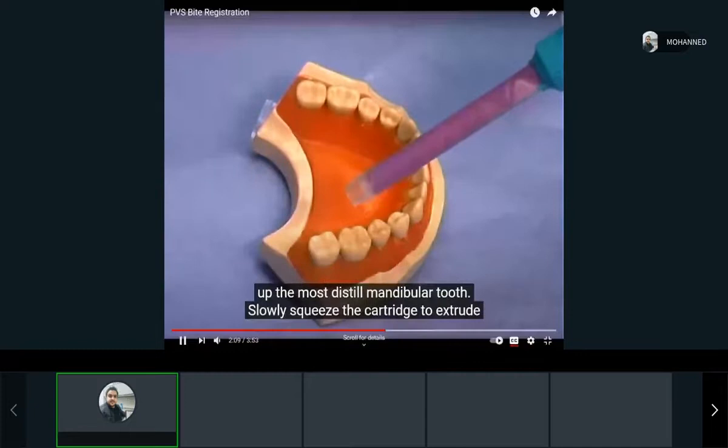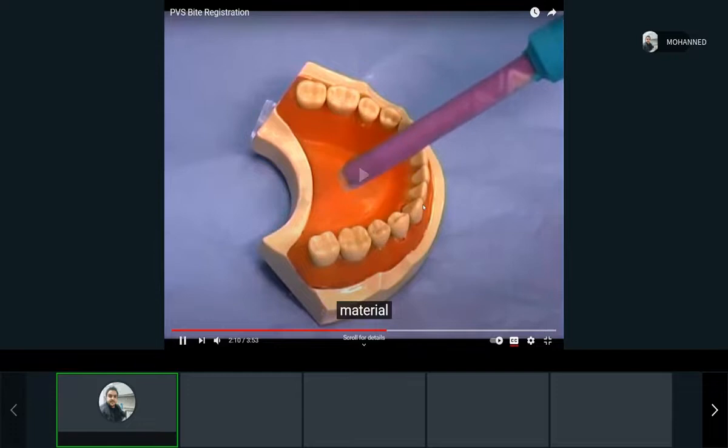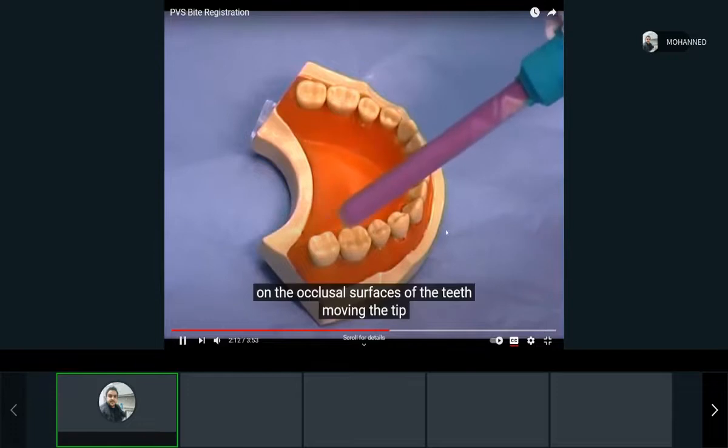And you can see how this thing is just mixing it for us. The mixing tip has a shape like a helix in a way, right? Whatever it is called, it mixes it for us. So that's a good thing, and that's why you get a good mix. Usually you would extrude a little bit out just to make sure the mixture is correct. Anyway, that will be in the lab.